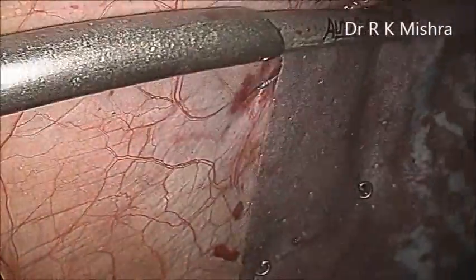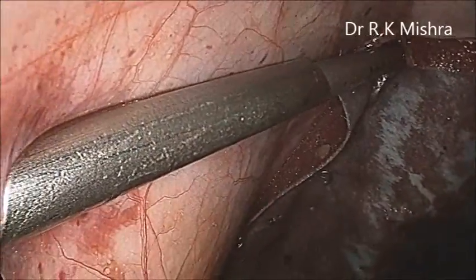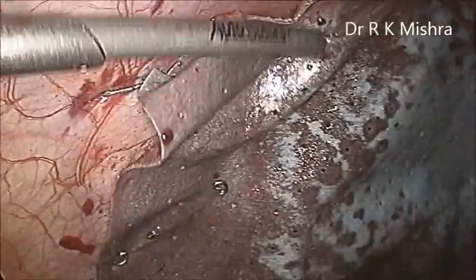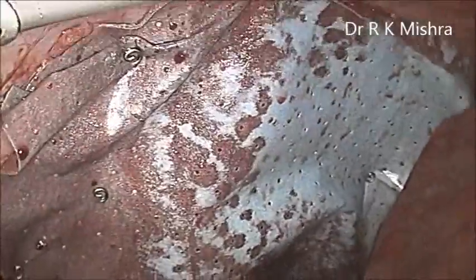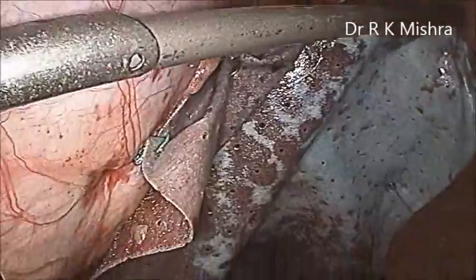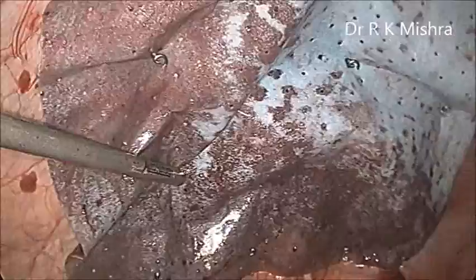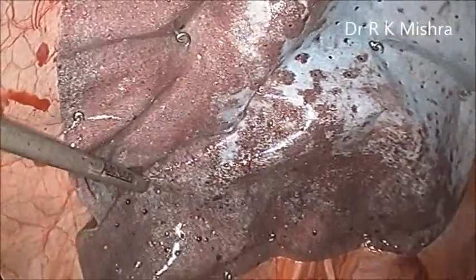This surgery was just done on the 18th of this month, September 2012. We will discharge the patient tomorrow. It is a very nice surgery without any problem. Actually, ventral hernia surgery in my opinion is one of the easiest surgeries to perform — especially by laparoscopy, and especially the onlay — it is child's play, it's a very easy procedure and you can perform it without any problem.